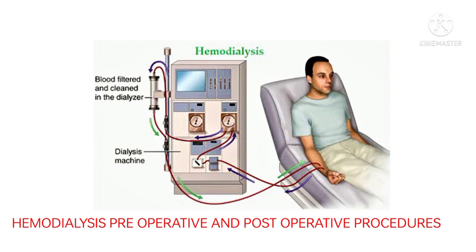Surgery is done to place 2 rubber-like silicone, silastic cannulas into the forearm or leg. The 2 cannulas are connected to form a U-shape. Blood flows from the client's artery through the shunt into the veins. This access can be created quickly and thus is particularly suitable when dialysis must be started immediately. However, infection at the site of insertion and clotting are complications that often necessitate removal.